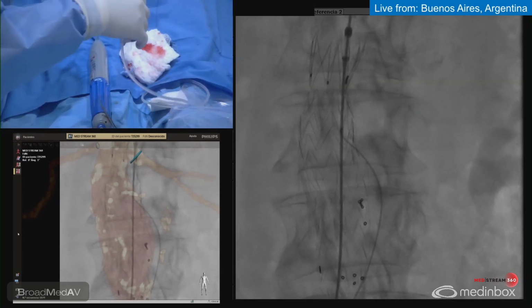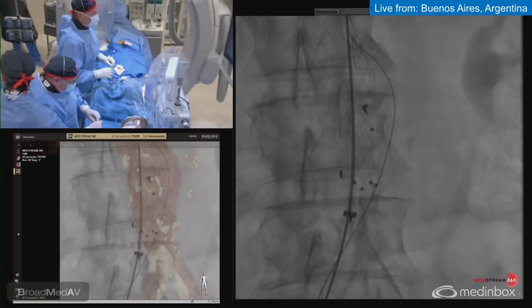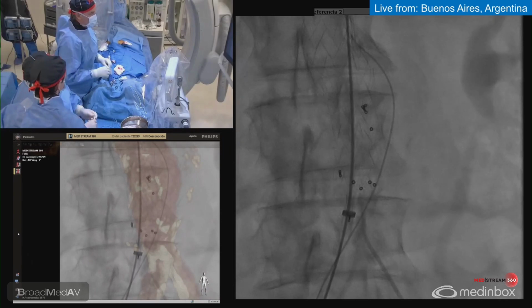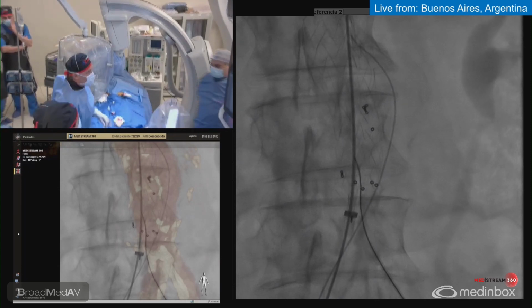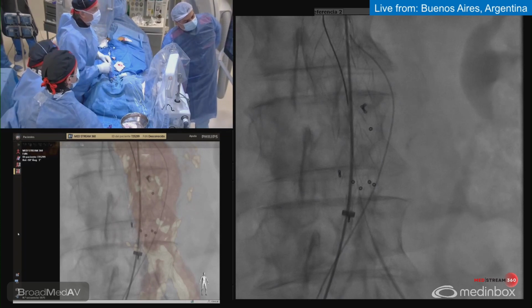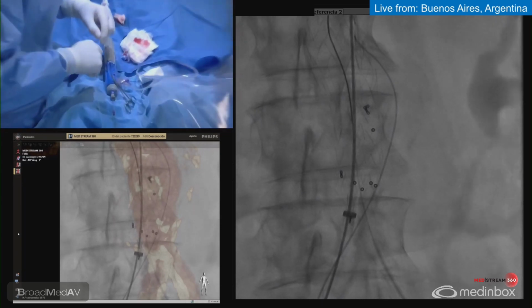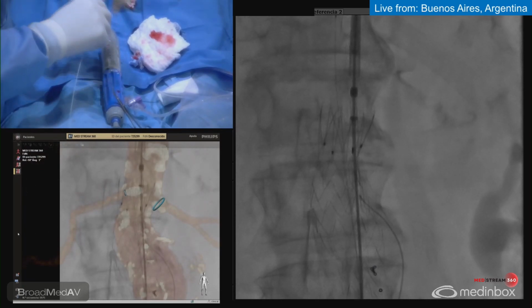And hydrophilic wire, so Erika is going to go here. This product is also low profile. You can navigate very well. Yeah. Isn't it? Tortuosity, short neck, angle. I'm not sure if I am in. Hopefully, yes. I think that it would be very useful for these difficult cases. Yeah, I think we are in.